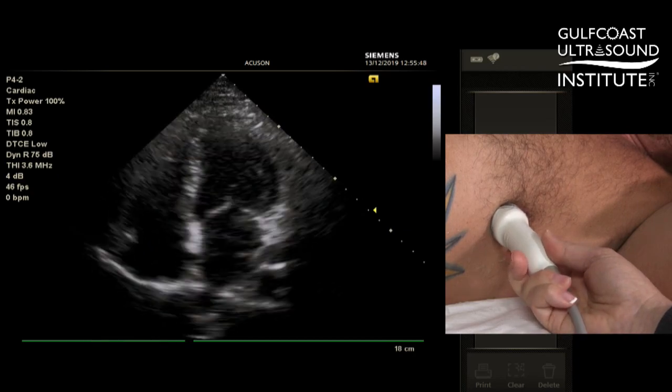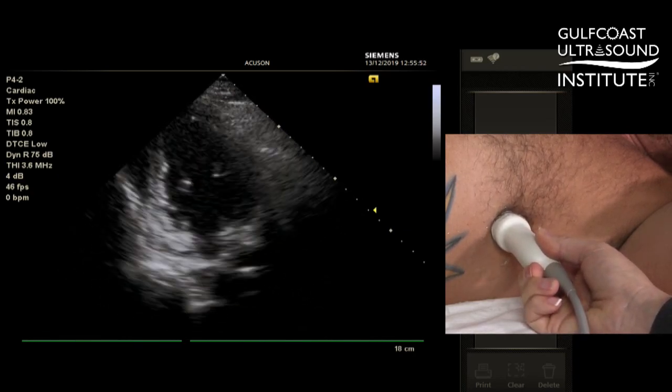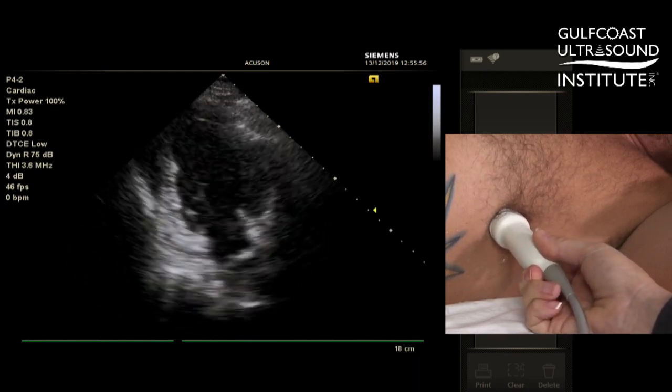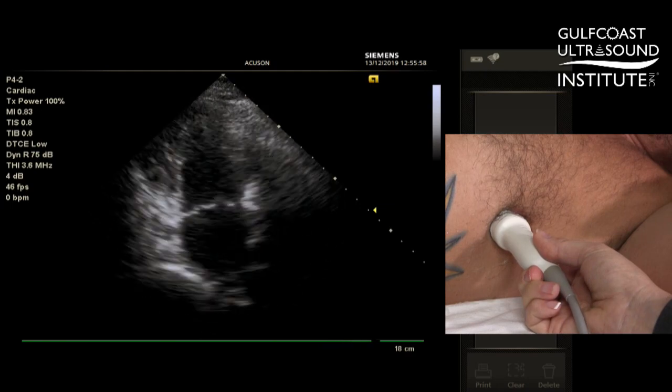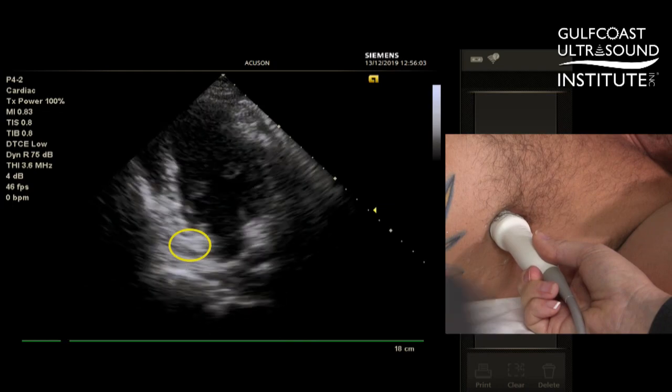One-quarter turn to the left, dialing in your first view, is the two-chamber view. You know you're in a true two-chamber view when you see the coronary sinus to the left of the atrium.